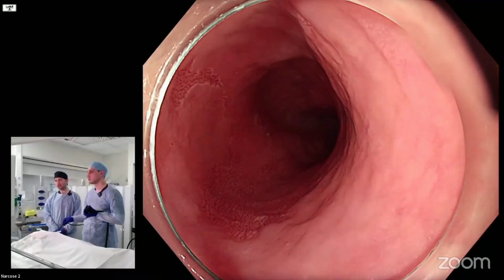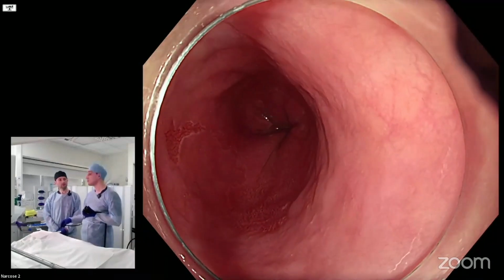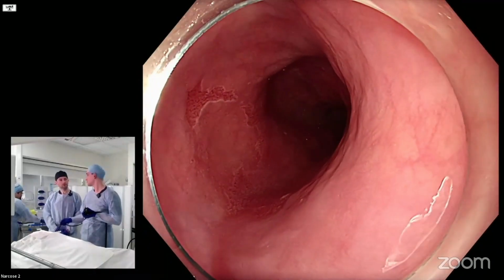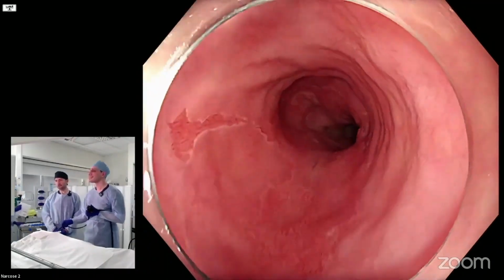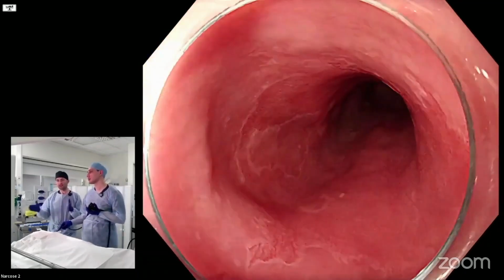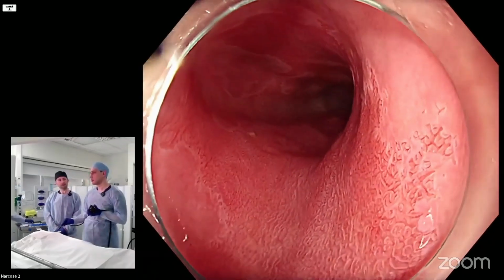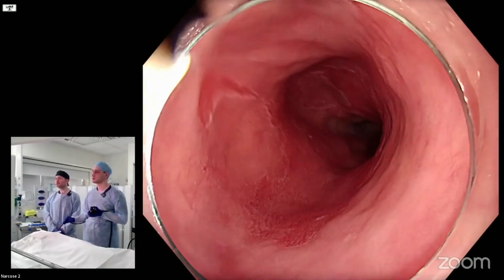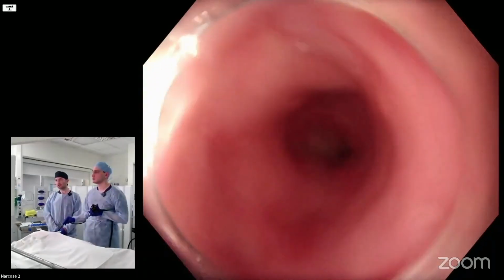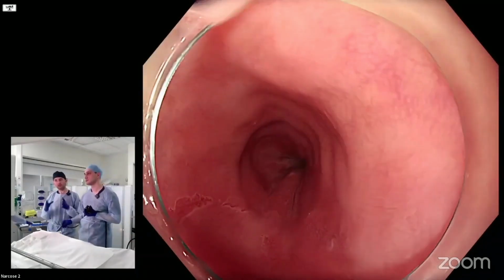So now let's characterize this based on acetic acid. How long are you waiting now? I mean, say that there's nothing there now. Is that fine? No. No. I would wait. So people have to wait like 40 seconds at least, right? 20 to 40 seconds is when you're getting these zones. So we're talking about ELAW, early loss of aceto whitening. You'll see this term used today a lot. There's a very important concept in Barrett's esophagus because acetic acid assessment is so good, so useful, so quick to interpret.